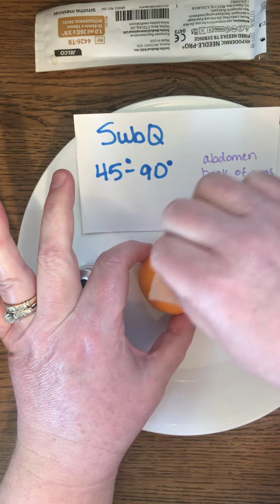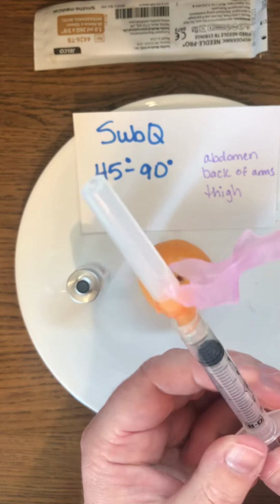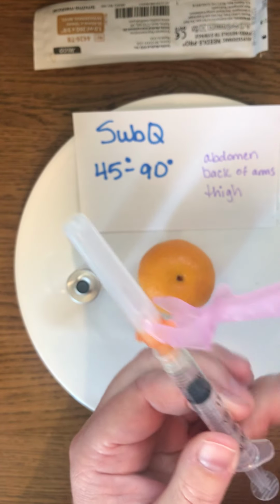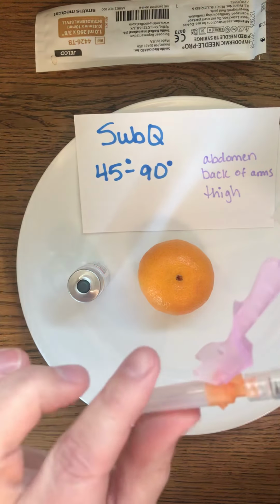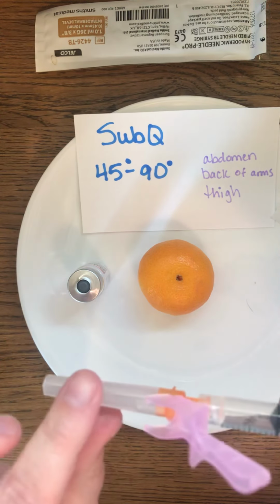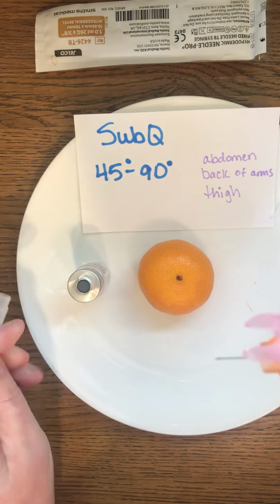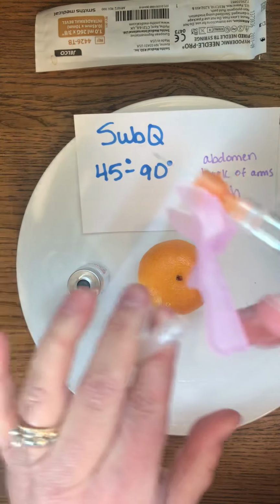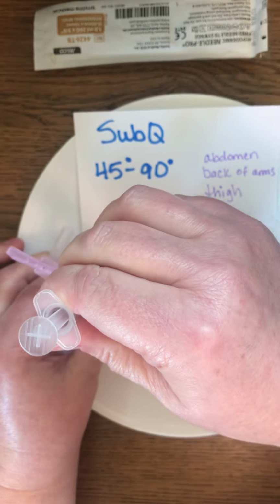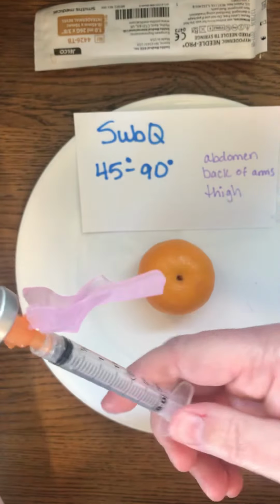Typical locations are going to be the fatty areas, because remember, subcutaneous tissue is fat. So the back of the arms, the thighs, and the abdomen are the typical areas that we're going to be giving these injections. So like always, we're going to pull up the amount of air. So if we're going to take out 1 ml of fluid, we're going to put in 1 ml of air into the vial. And again, you don't want to put this cap down because once this cap is put down, you cannot recap your needle. So we're going to go in. Push the air in, and then we can flip it up.